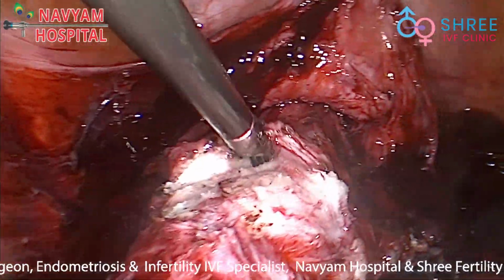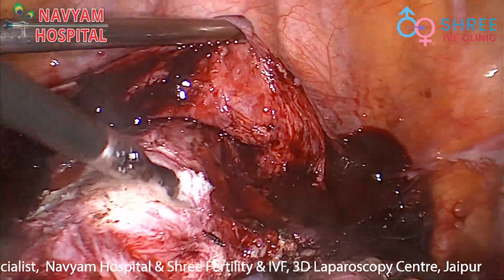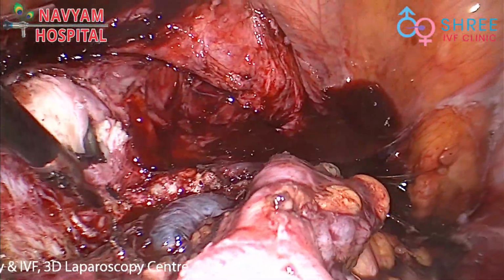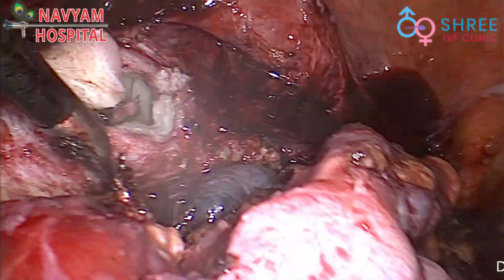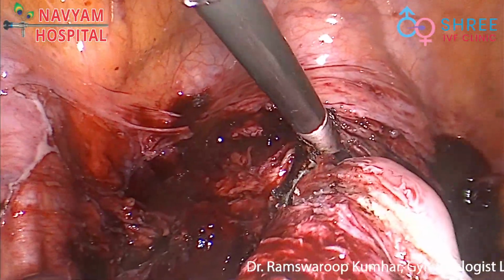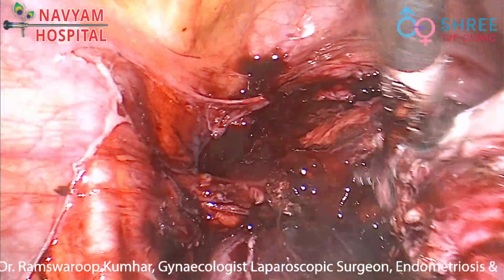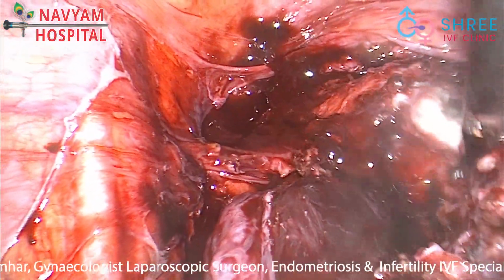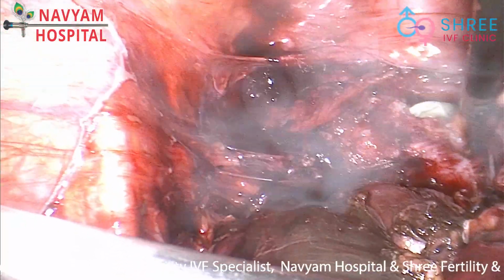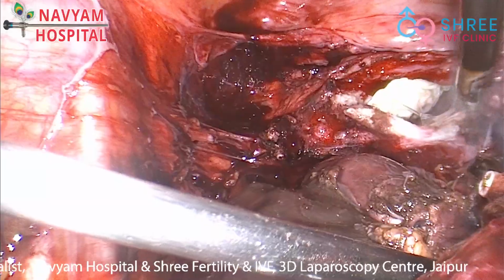For cutting, proper traction is essential. Here the sharp cutting current was used for the vault cutting, and we have to avoid unnecessary coagulation at the vault, because unnecessary coagulation will hamper vault healing.